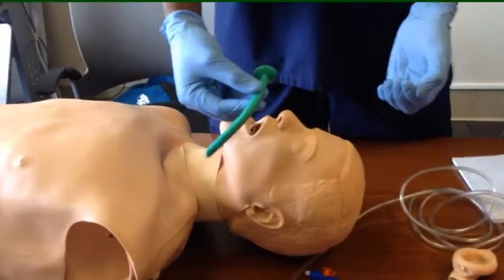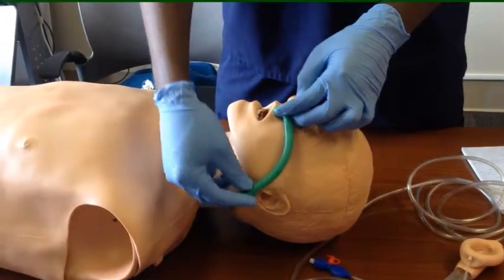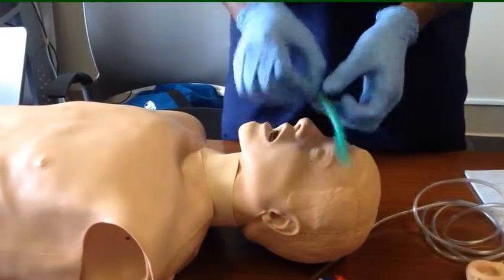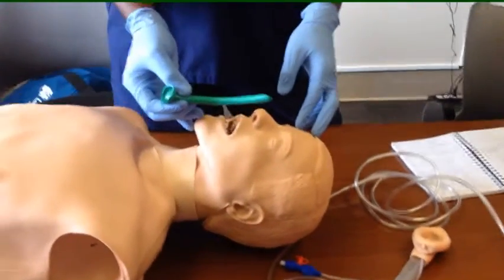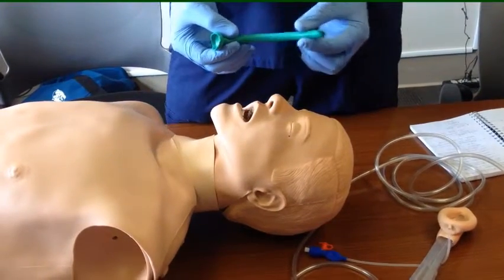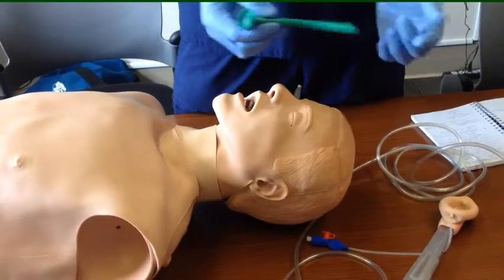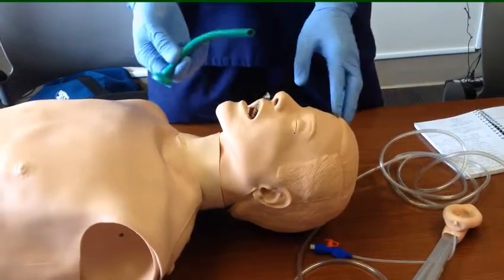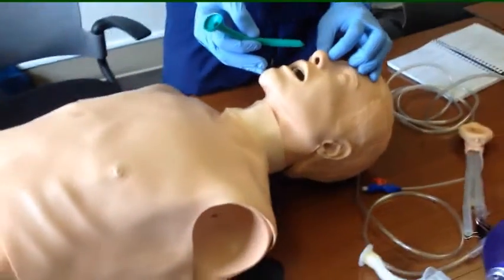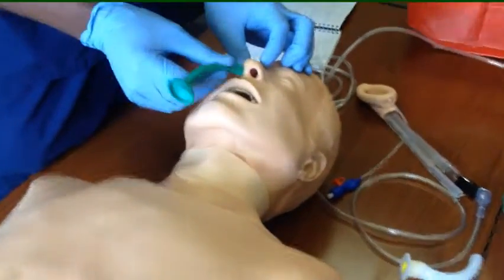Still, I have to individualize the size I'm using to my patient, measuring from the end of the nose to the end of the earlobe. So, like you can see, that's the right size. To prevent causing damage to the nares and nasal septum, I have to lubricate the NPA device. So, I have put some lubricant, and I choose one naris to use, and when I'm inserting it in, I insert it using a twist motion.